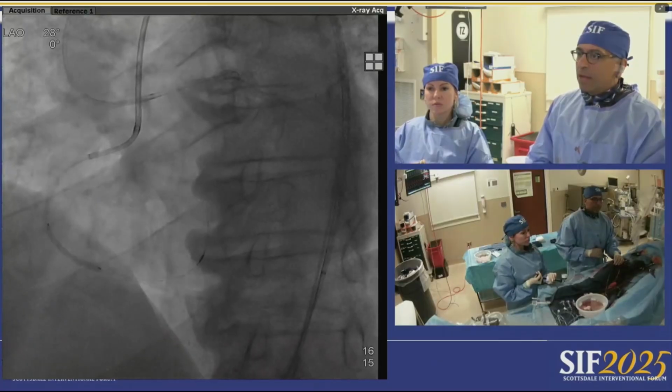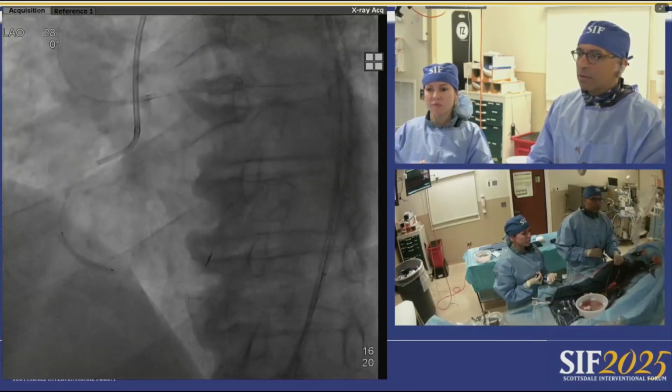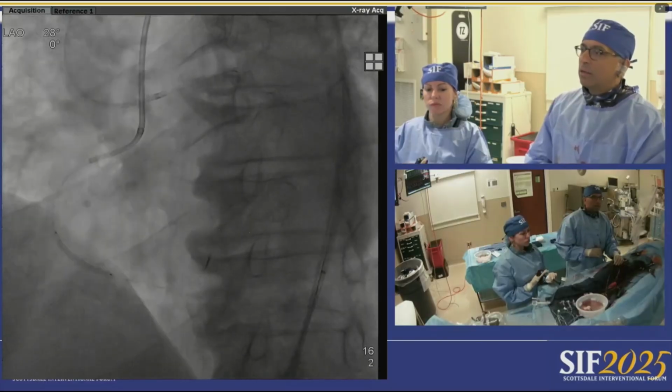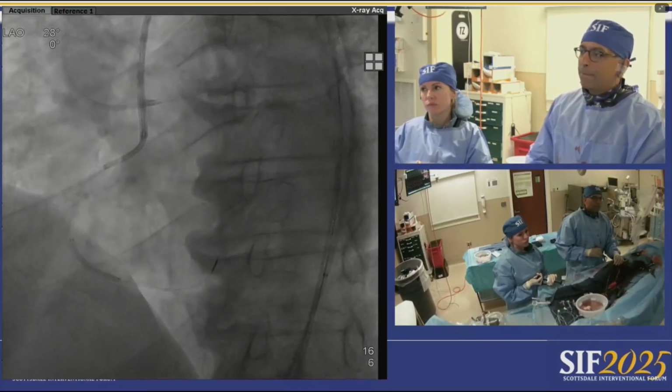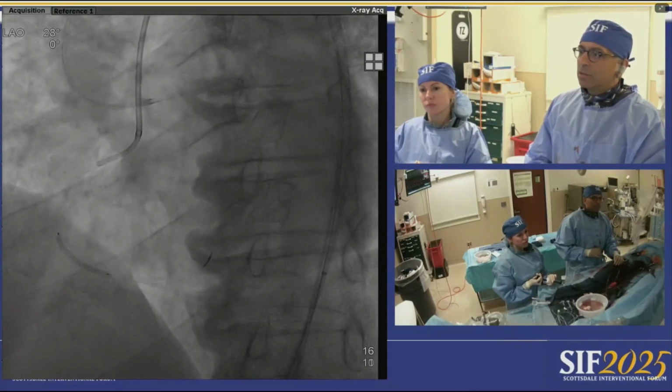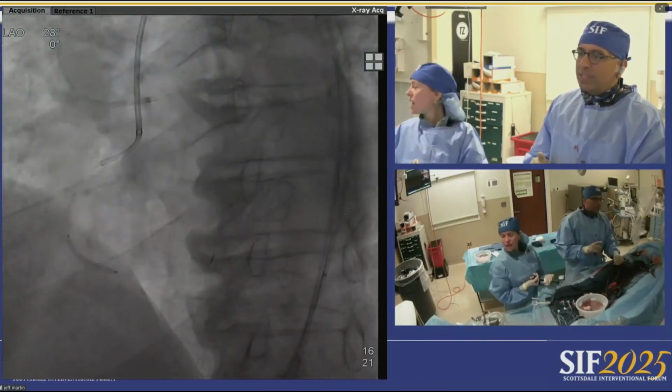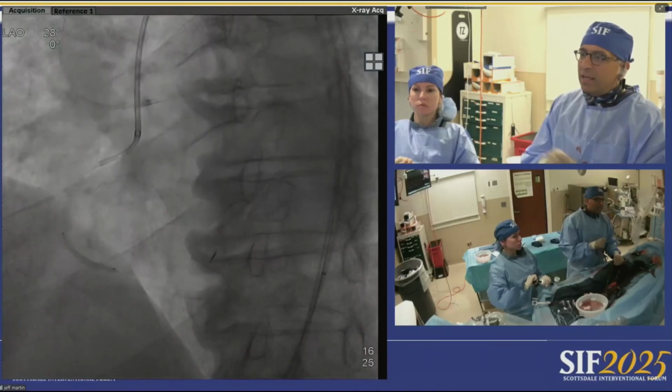Again, these are things you need to develop a skill set, and you also need to be willing to say, like Manish said, "I don't know what stent platform will go to what size, so I have to look at it all the time with the fellows and figure it out." Because the worst thing you can do, for one second, is put a stent in that's too small.